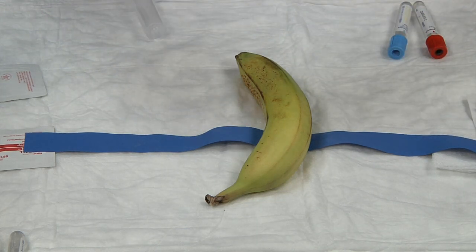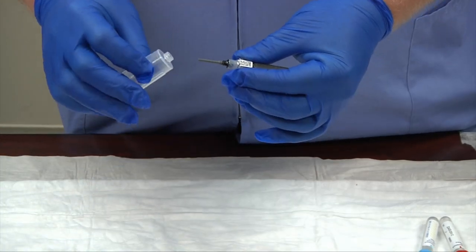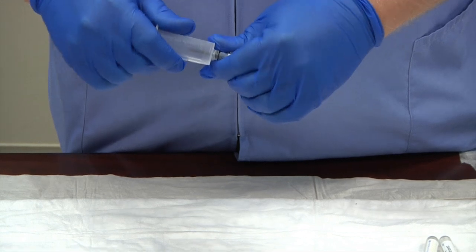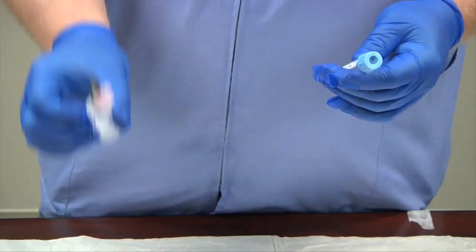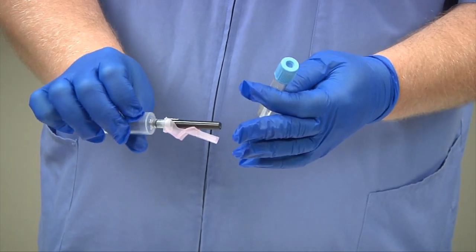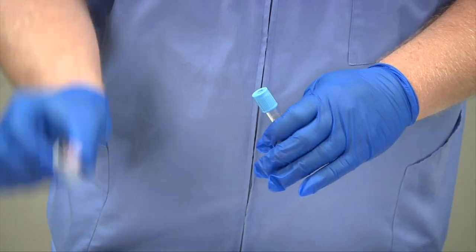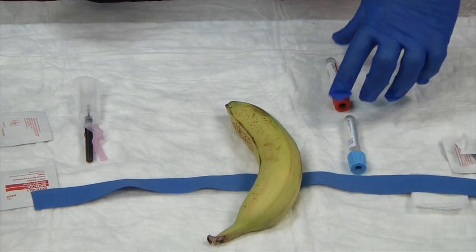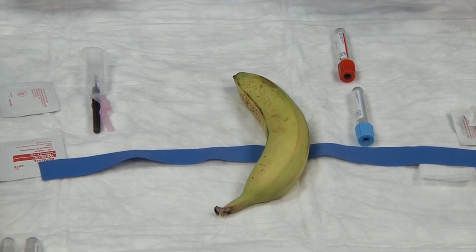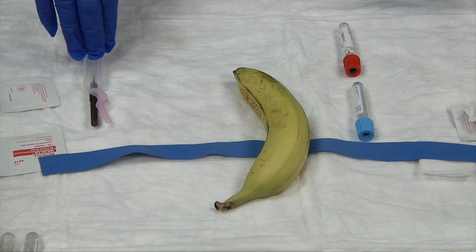As the alcohol swab is drying, assemble your needle while checking that it's still in date — it is, and the seal is intact. Tear off the end of the multi-sample needle, insert it into the holder, and tighten carefully. Also check that your tubes are in date. Needles can expire — their sterility can expire — so check the label on the needle to make sure the paper sticker is intact. Expired tubes lose their vacuum suction, and expired needles no longer guarantee sterility.